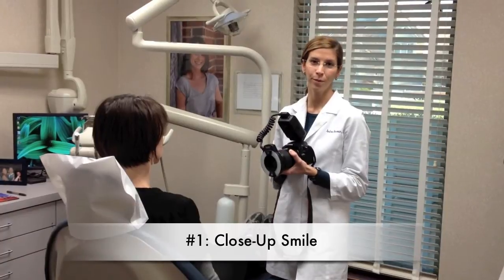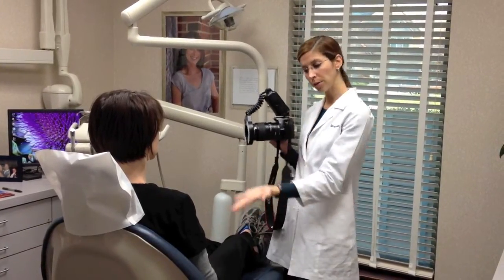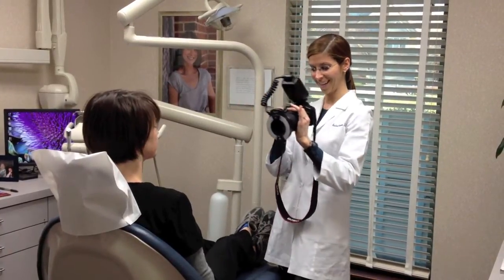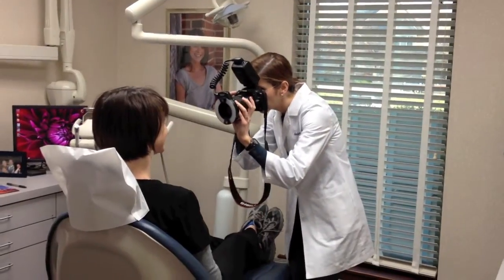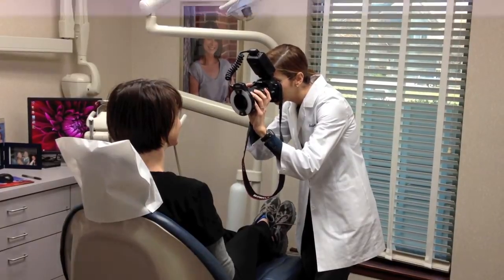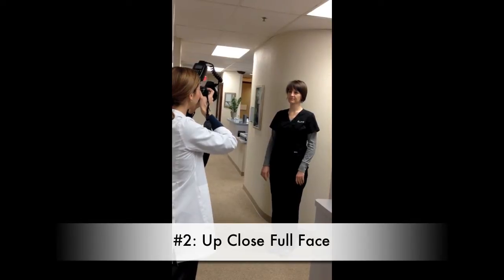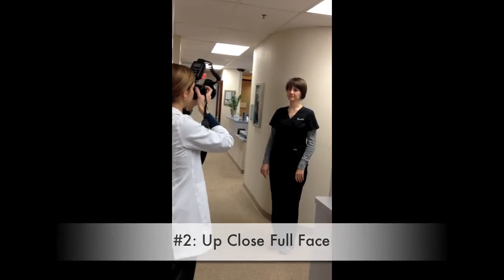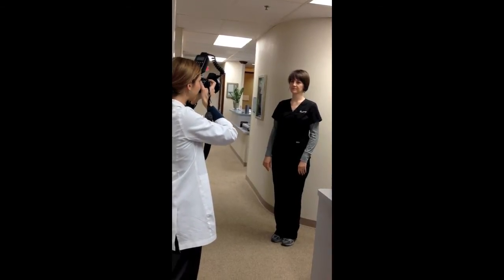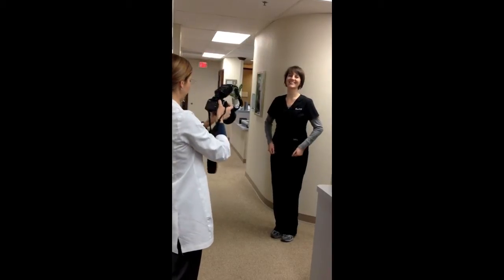The first picture I like to take is a smile shot. I'm trying to frame it from one corner of the mouth to the other. I want to make sure the patient is just about on my level and I have them turn their head toward me. Thanks, Courtney. And big smile. Okay, good.